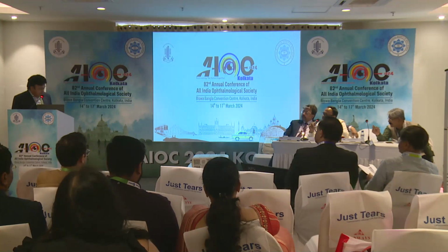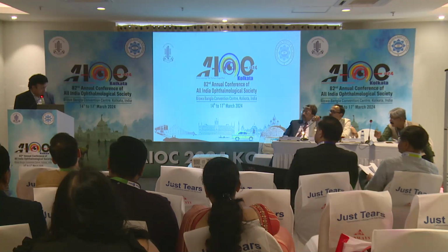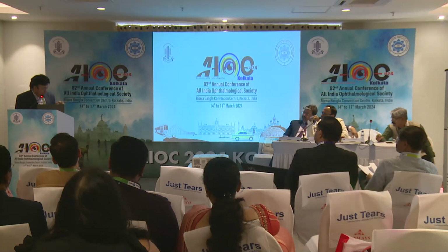So these lenses were already there. As you could see, this patient was 2 years post surgery, operated elsewhere, of course. And because his lens kept on moving in the eye, what we have done is we have just refixated the lens with the help of these flanges.